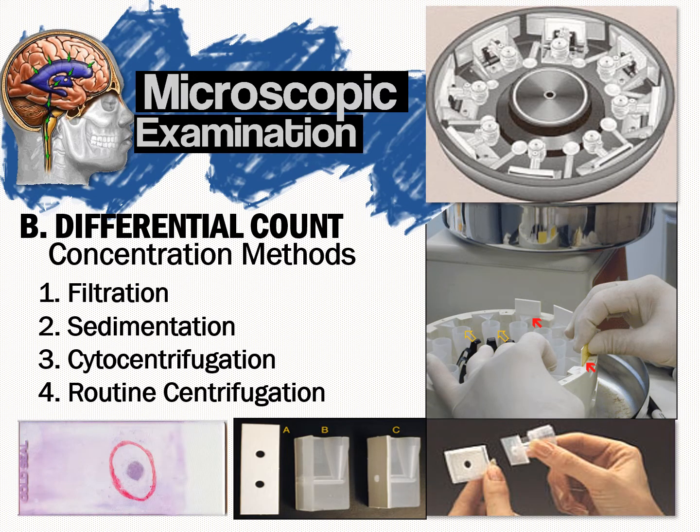The next microscopic exam is the differential count, which is performed on a stained smear. Before a differential count is performed, concentration methods will have to be done.